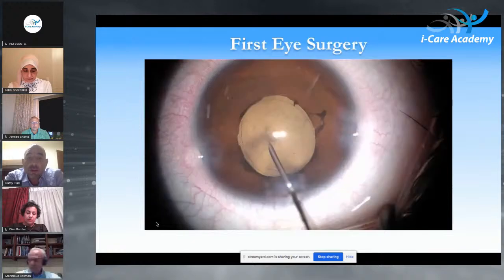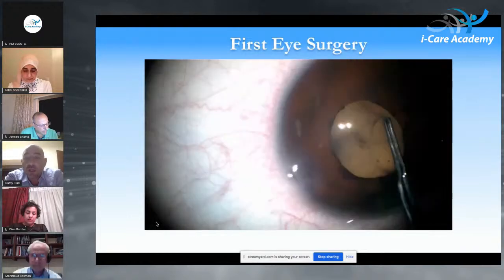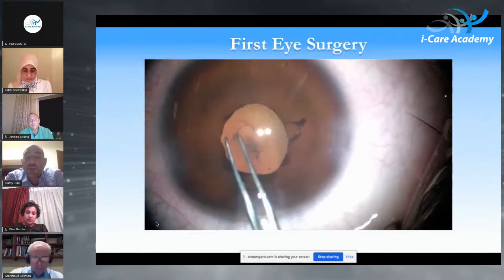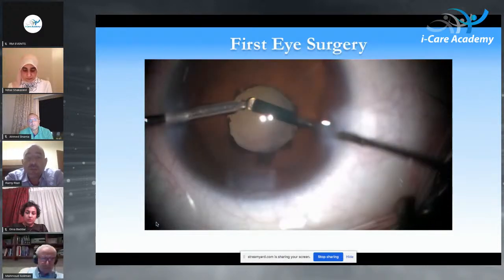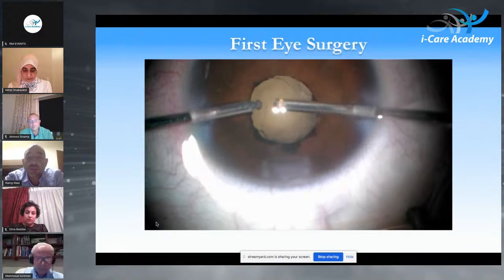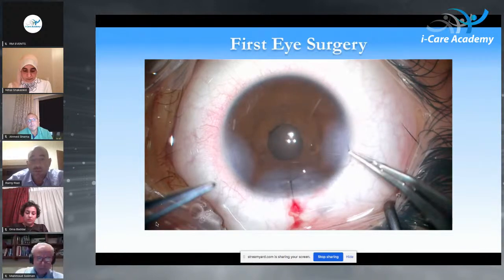And then after completion of the removal of the nucleus, a simple posterior rhexis, as you can see. As Dr. Nihal explained, we prefer to keep the posterior rhexis smaller than the anterior rhexis for future implantation if possible, limited anterior vitrectomy, and this includes the first eye. Of course, we put some sutures to make sure that the kid does not rub.